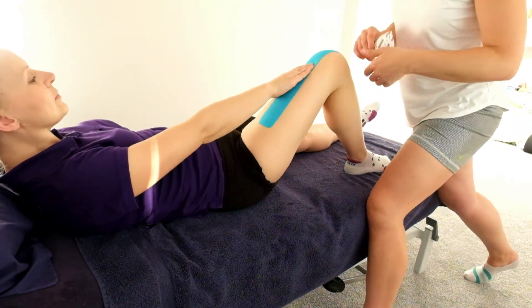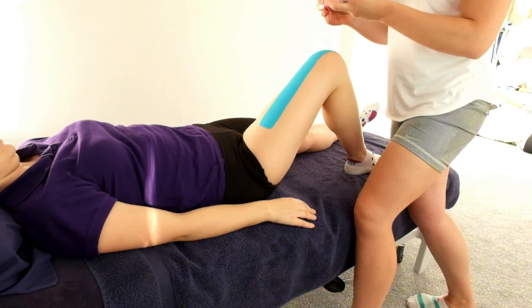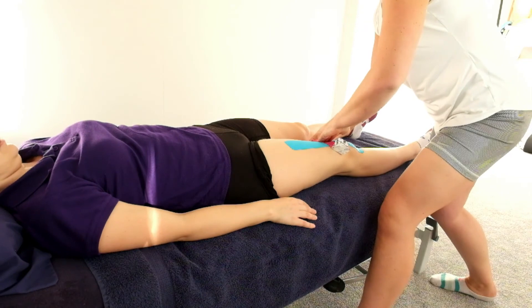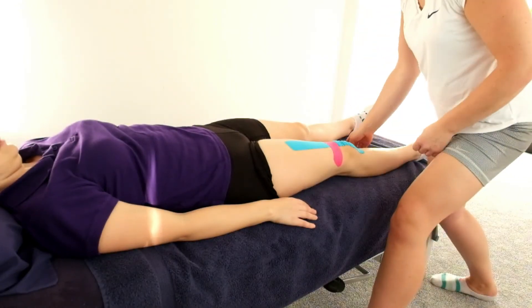Next up, desensitisation. The client indicates where they feel pain. With the tissue on stretch — knee flexed — peel back the middle of the tape, apply a light stretch, and place directly over the sensitive area. Peel back the anchors and anchor with no tension on the tape and no stretch.